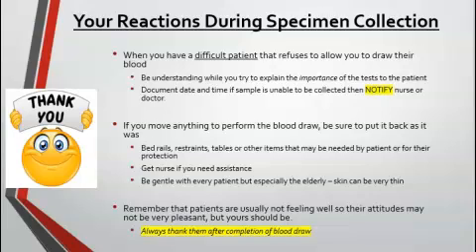To complete a blood draw, you may have to ask a nurse or a CNA for assistance, so don't be afraid to ask for help if needed. Also, be gentle with our elderly patients because elderly patients tend to have very thin or brittle skin, and it can be easily damaged with a tourniquet or when we're performing a blood draw.